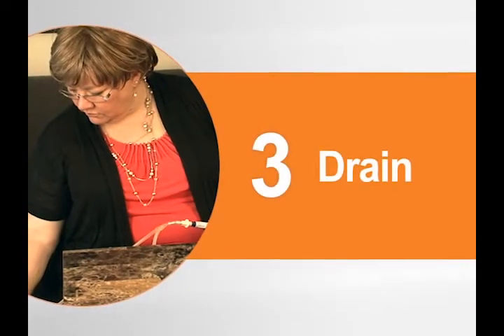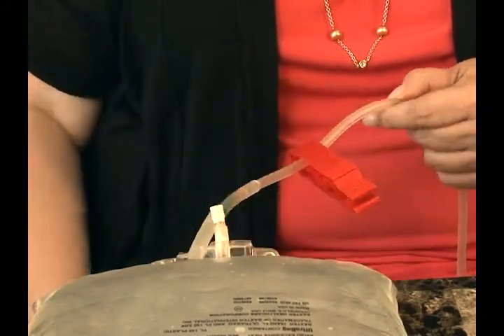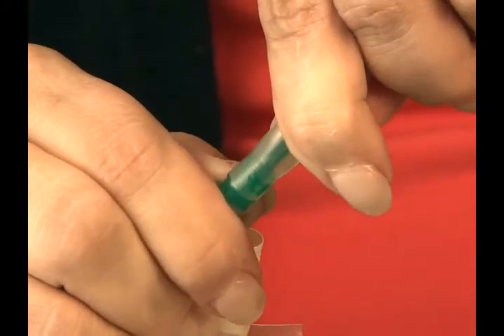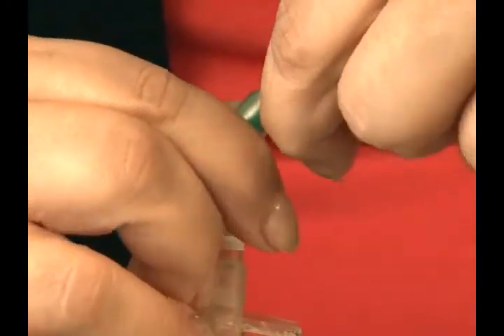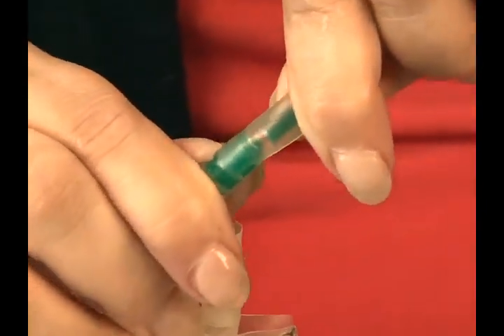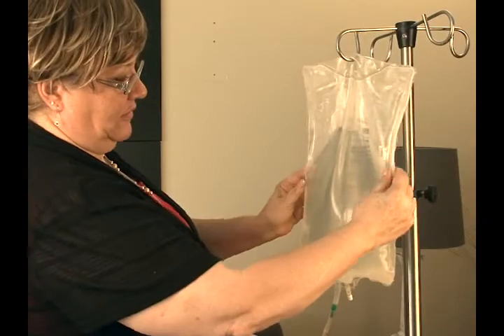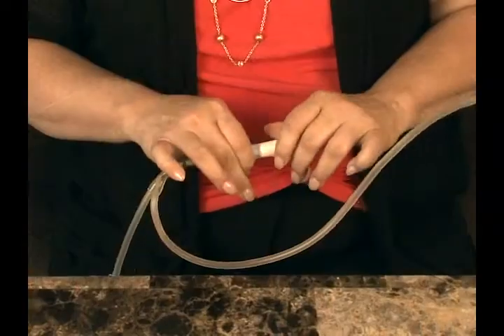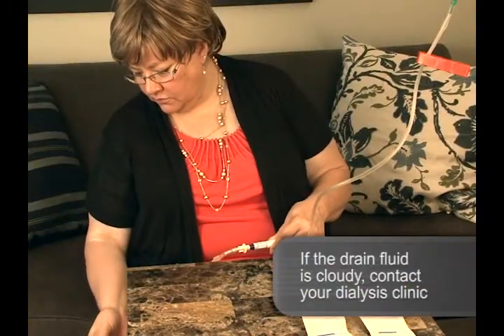Next, let's take a look at how to drain. First, clamp the fill line with the UltraClamp tubing clamp. Next, break the green frangible near the solution bag using the same method you used to break the blue frangible. Hang the new solution bag on the IV pole. Place the drain bag in the drain position below the level of the abdomen with the shiny side up. Open the transfer set to drain. Remember to check the drain fluid for cloudiness.